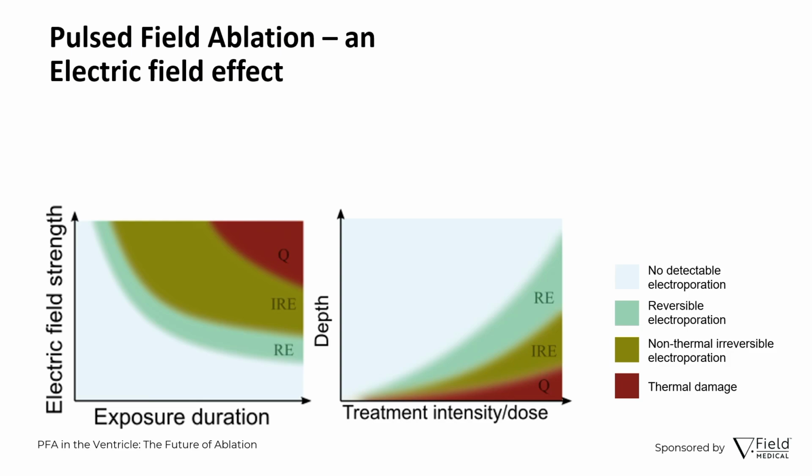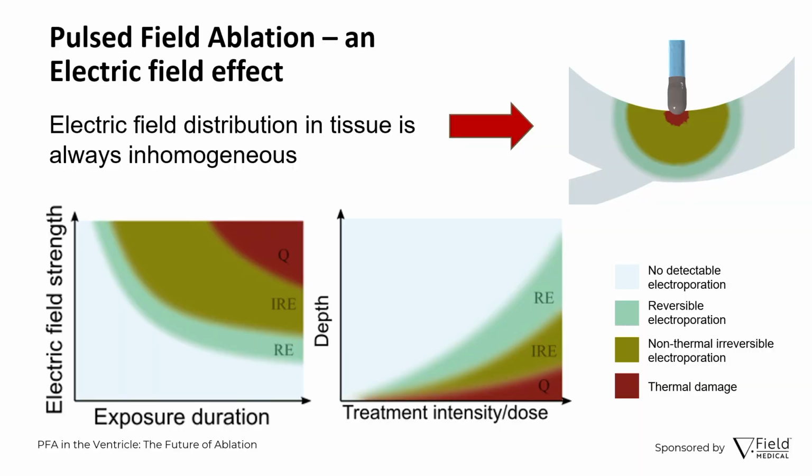And the other thing that I want to discuss is a little bit up, so now on the tissue level, because cells will eventually form a tissue, and quite often you will be told that we are going to do the irreversible electroporation, or we're going to do the reversible electroporation, and so on. That's not really what happens. What really happens is, because the field is very inhomogeneous in the tissue, and here's an example, you will have eventually all of this happening.